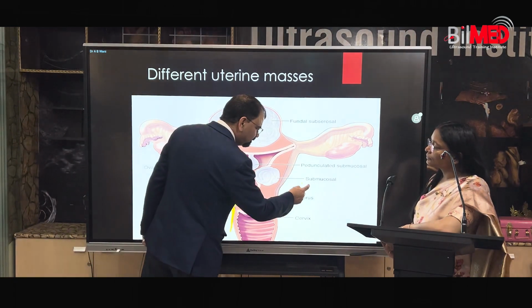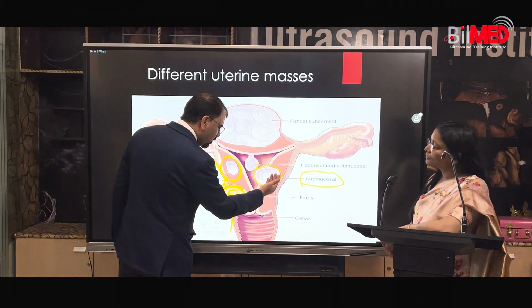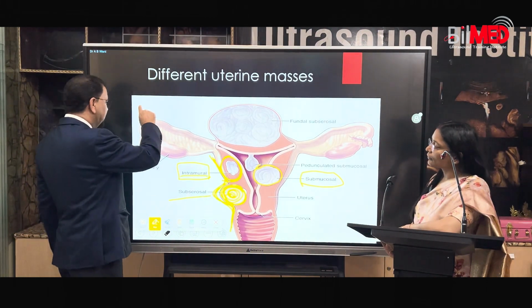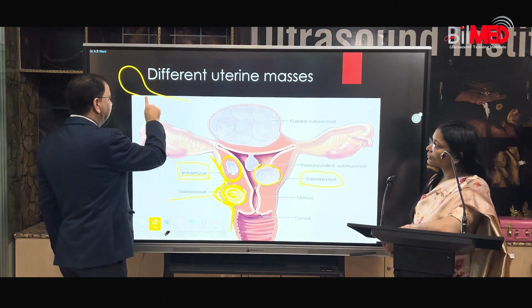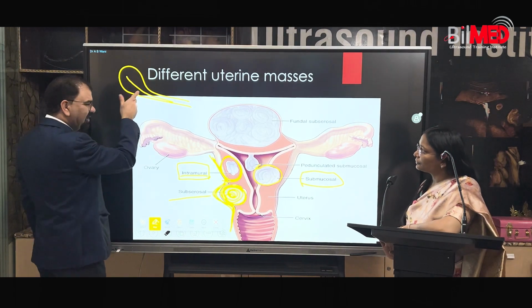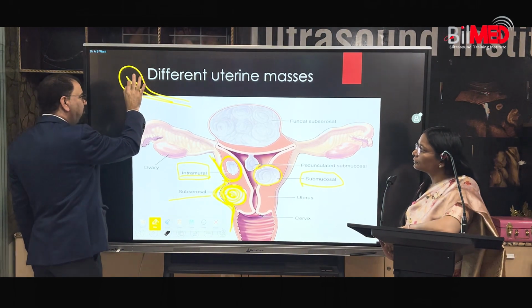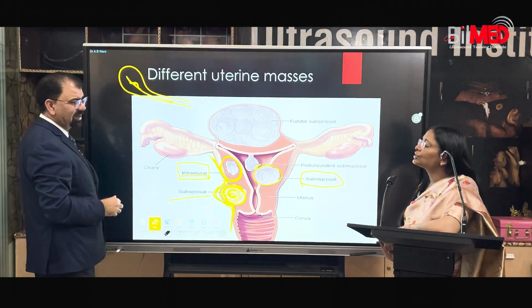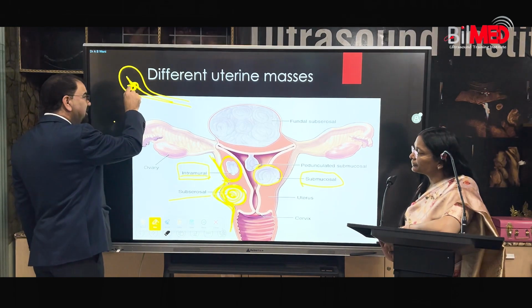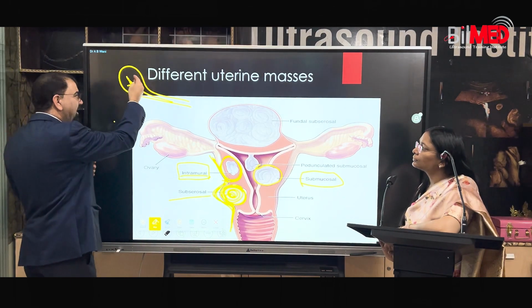The intramural fibroids, as the term itself, intramural, they will be inside the walls. Now, another one, submucosal fibroid. Now, the submucosal fibroids, if there, will be compressing onto the endometrial cavity. Now, if you see, for example, there is a uterus over here on ultrasound, and you will be seeing an endometrium like this, but all of a sudden you see this endometrium having a bulge towards anterior or towards the posterior. Then what you are dealing with? Then you are dealing with a fibroid. If you are not seeing that fibroid, because this fibroid is compressing onto the endometrial cavity, making it shift anteriorly or posteriorly.